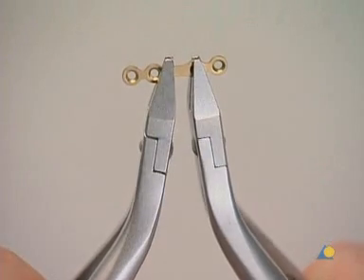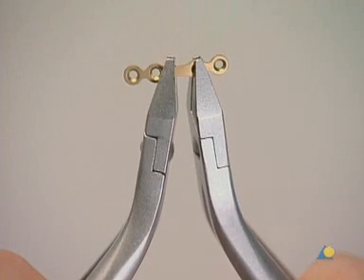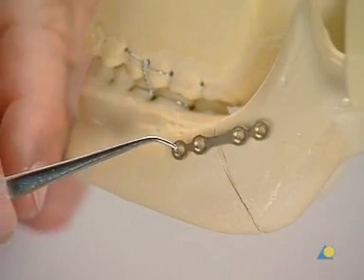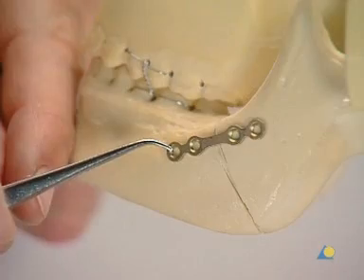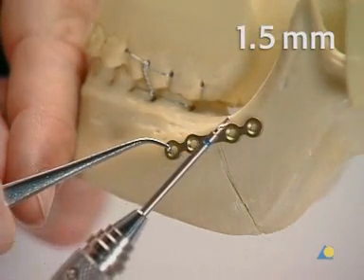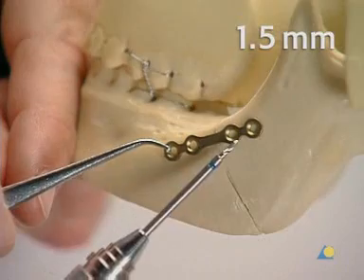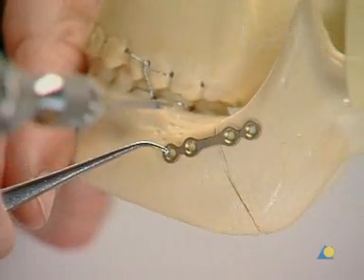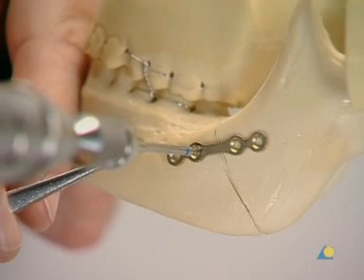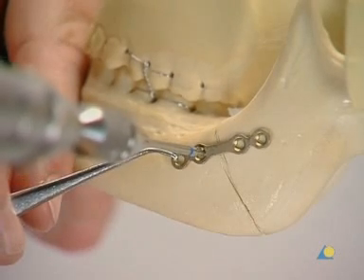The plate is contoured with bending pliers to match the anatomy. The first hole is drilled monocortically close to the fracture using the 1.5 millimeter drill bit with a 6 millimeter stop. Use of this drill reduces the risk of damage to tooth roots and the inferior alveolar nerve.